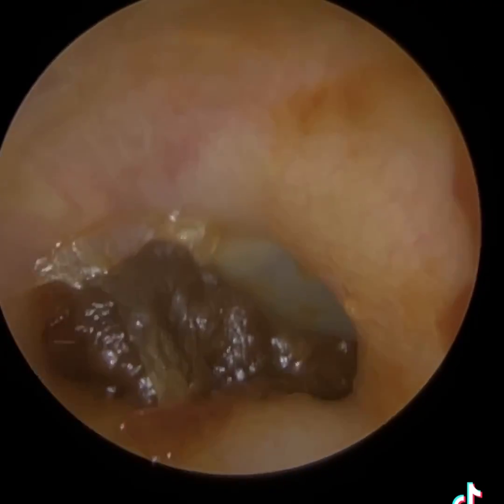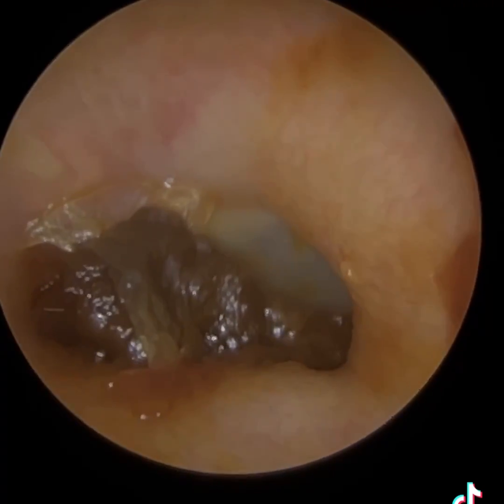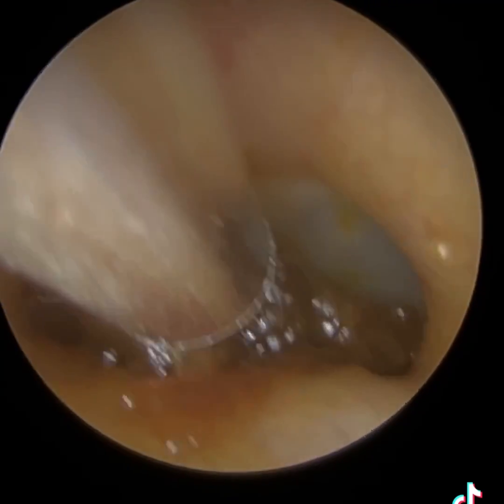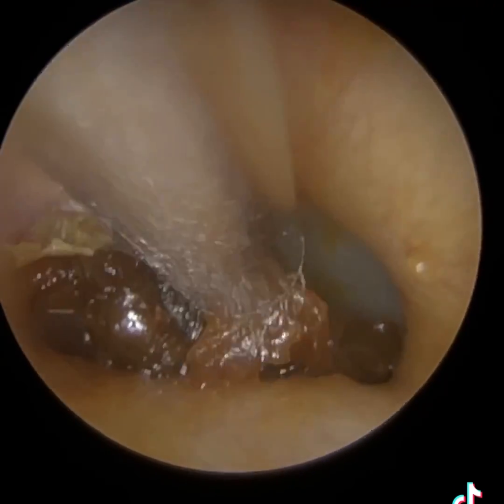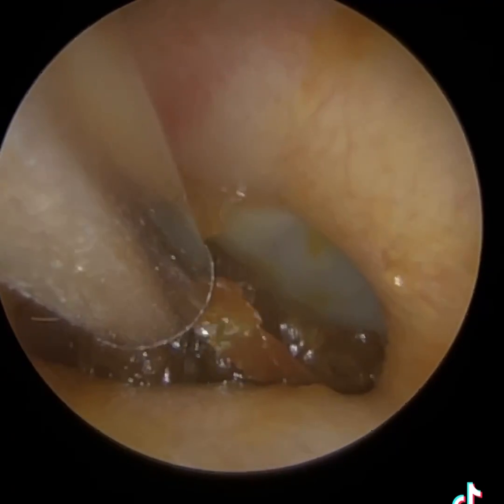This is of a patient who attended with sticky earwax that's impacted right up against the eardrum. This was caused by the patient trying to remove the wax themselves with a Q-tip, what we call in the UK a cotton bud.